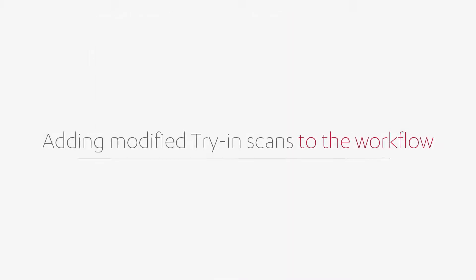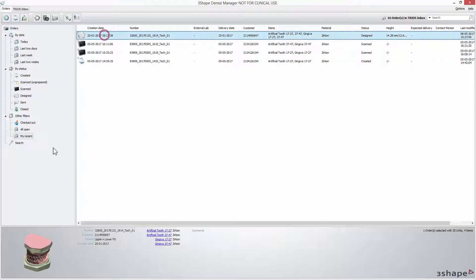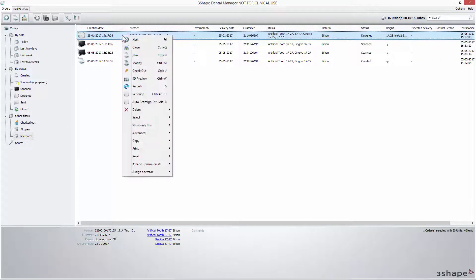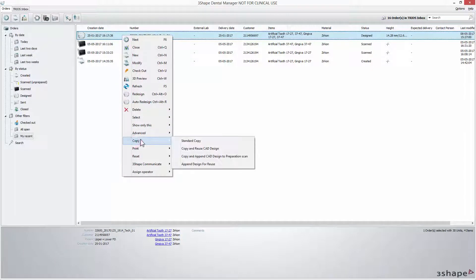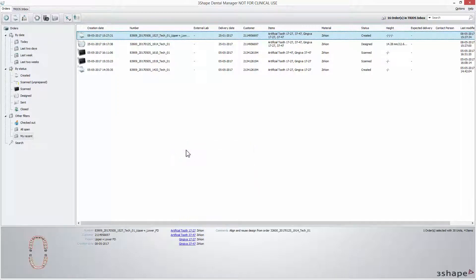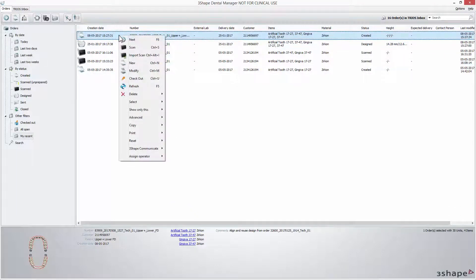To start the procedure of capturing modifications made during a fitting session, find the existing try-in order and right-click. On the drop-down menu select copy and then click copy and reuse CAD design. The new order will be created with all the settings and designs transferred from the old one.